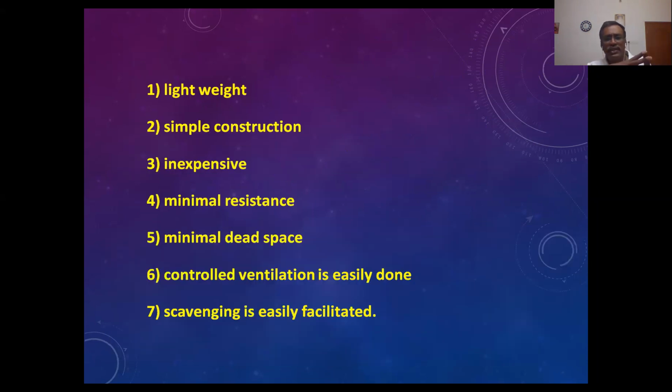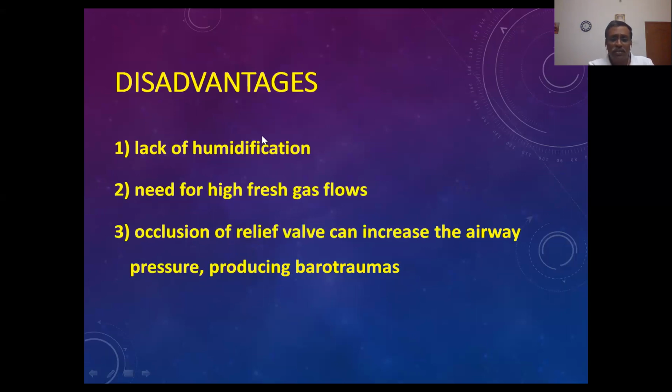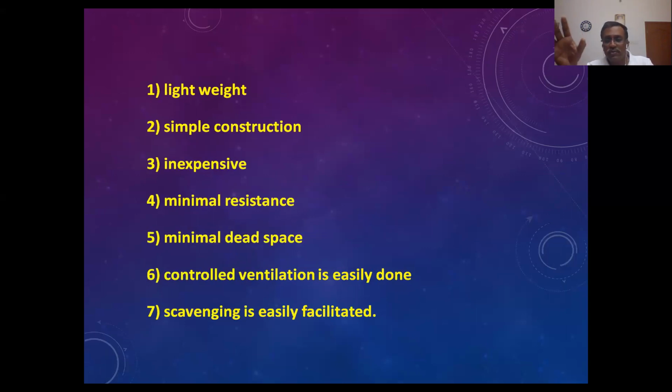This is the most important thing. It's very lightweight, and you can take this circuit anywhere else without any problem, and it is a very simple construction. And the most important thing which was left here is it has no valves. Actually, it has no valves.